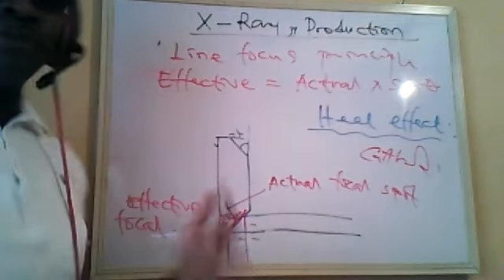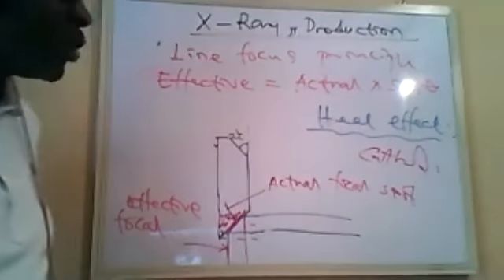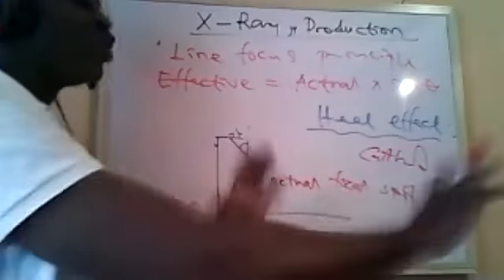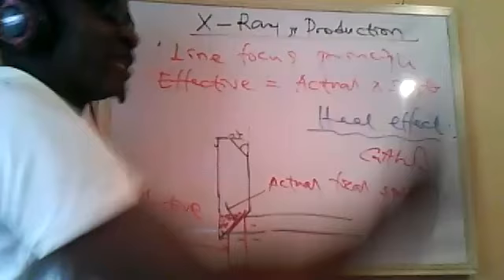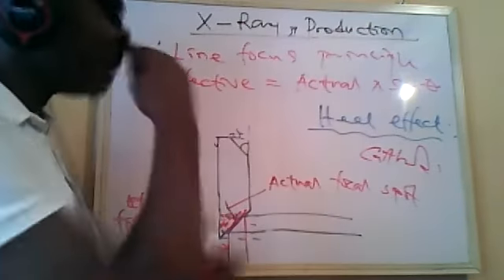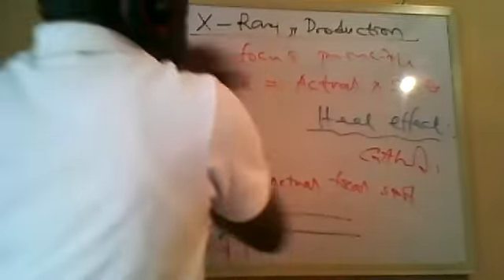If you want to image a patient, maybe the abdominal side, and the patient has a big tummy, it is best to place the bigger side of the anatomy, the thicker part, towards the side that has more energy, towards the cathode side, so that the much more energetic X-rays will pass through it. So this is the patient.